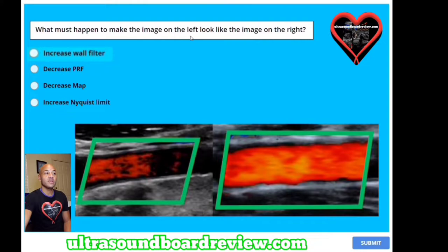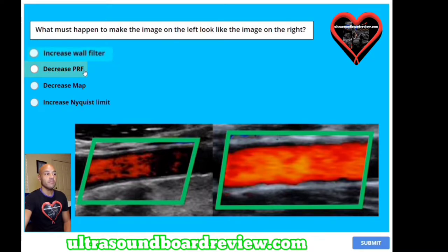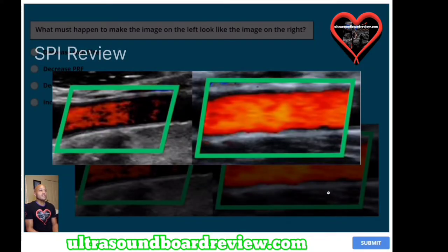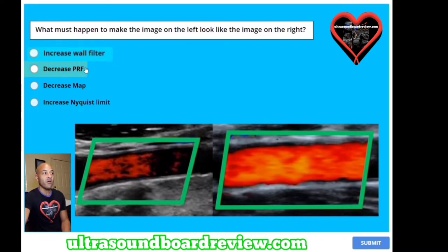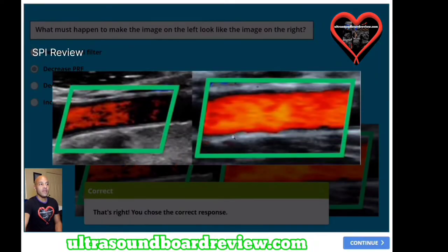What must happen to make the image on the left look like the image on the right? A) increase wall filter, B) decrease PRF, C) decrease map, or D) increase Nyquist limit. Right away it's pretty obvious that this artery here is not quite as filled in as this one over here — this one is completely filled with color Doppler. The answer is you're going to decrease PRF.